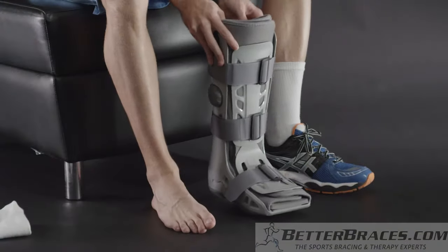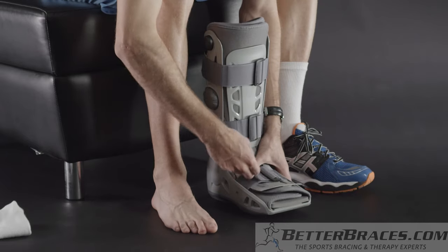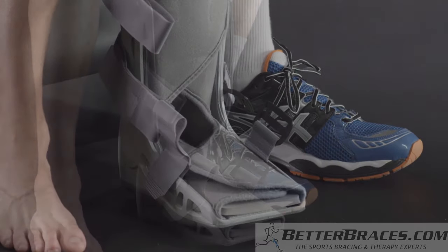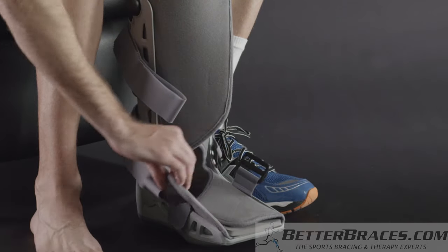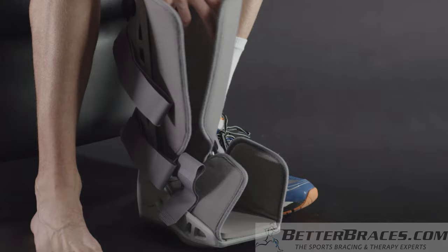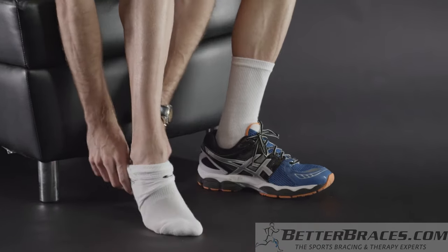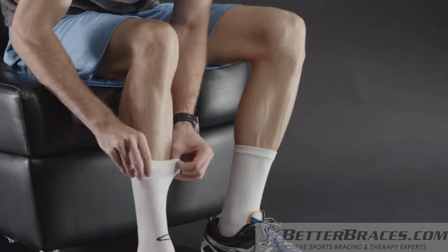To prepare the AirSelect Standard, unfasten the straps, remove the front panel, and open the liner. Before you apply the boot, you may want to slip on a cotton or cast sock to enhance the boot's comfort.